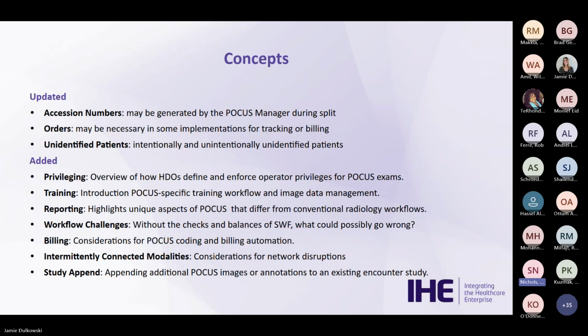And so through the work with ACEP, we expanded the concepts section with several areas that we have listed here. Again, we've mentioned these: privileging and training are a big part of point of care ultrasound, and the distinction between privileging and credentialing, reporting. There's all kinds of workflow challenges.